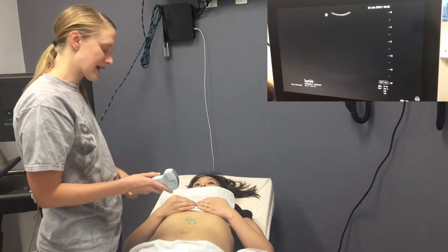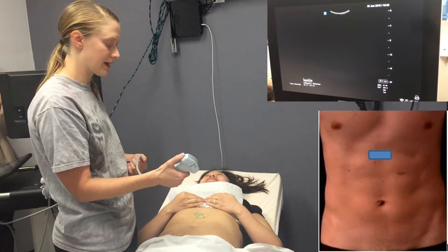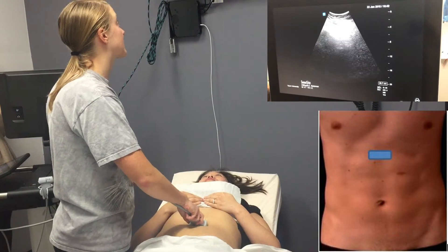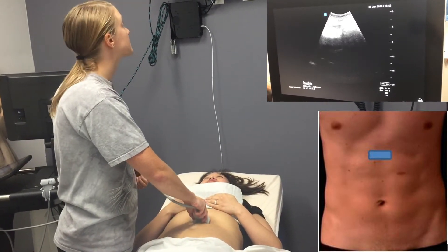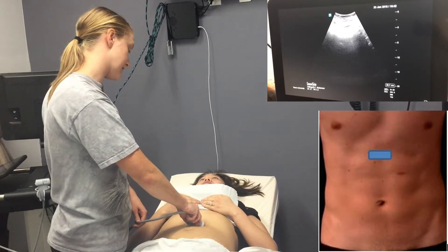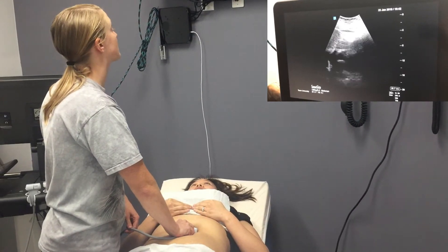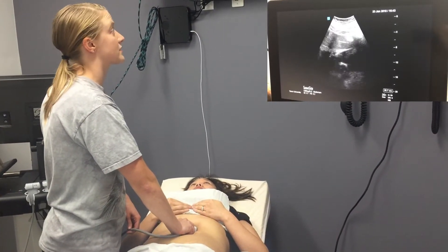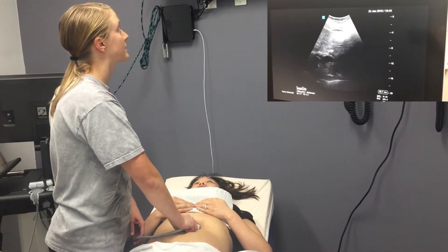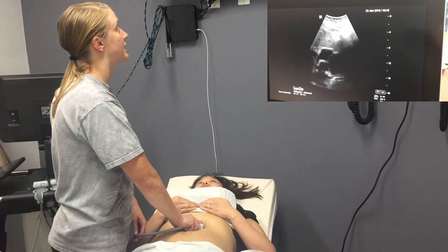I'll start with a sub-xiphoid view. With the abdominal exam type, I'll point my indicator towards the patient's right, go sub-xiphoid with my hand on top of the transducer so that I can apply some pressure in the epigastrum, and then fan more anteriorly to bring the heart into view. We want to make sure that our depth is deep enough to see the entire pericardium, and we're looking for free fluid within the pericardium.